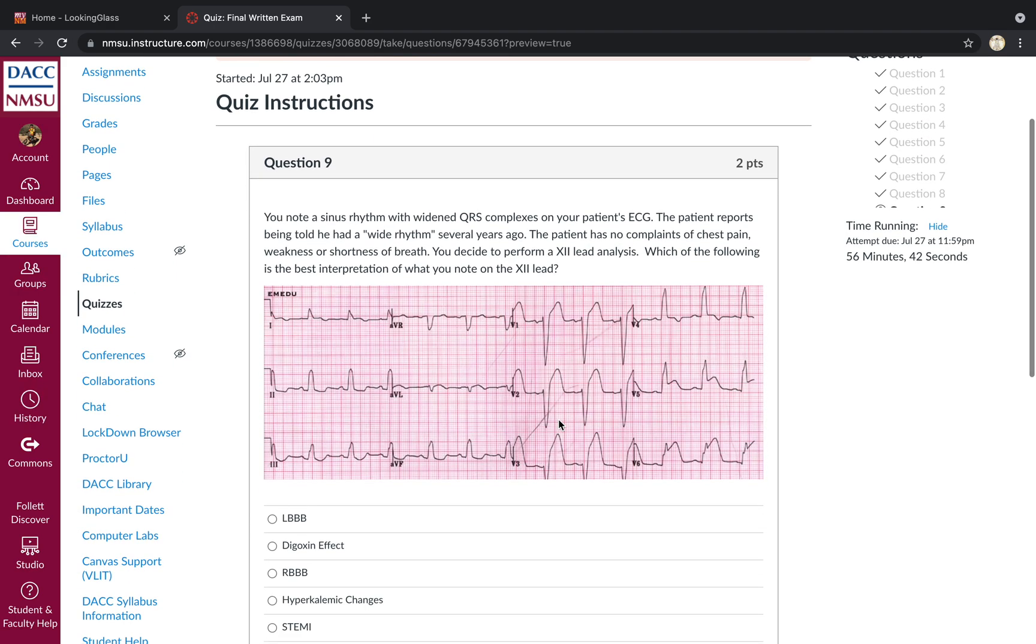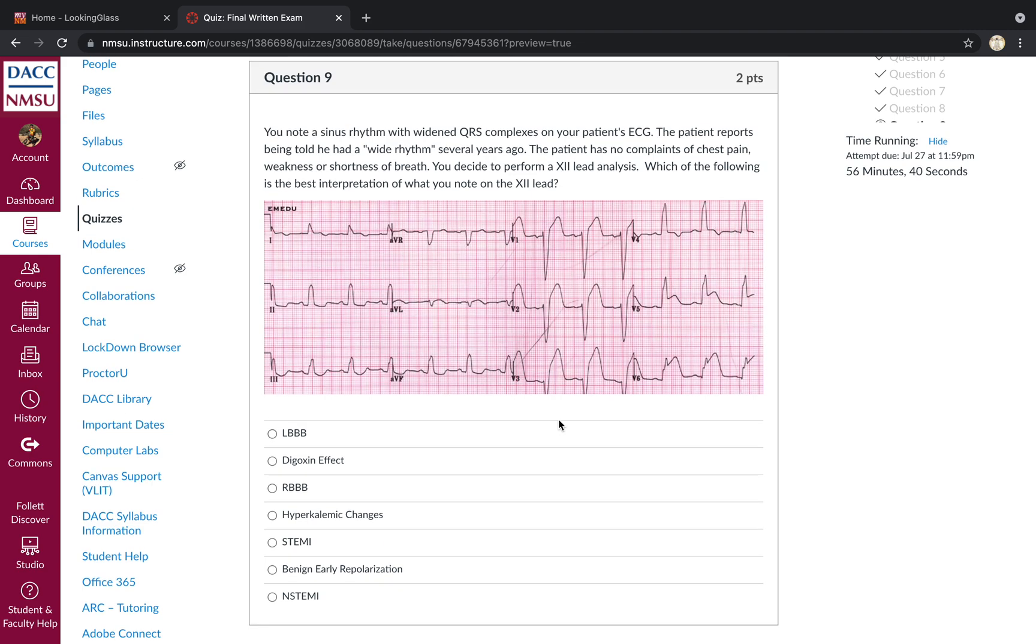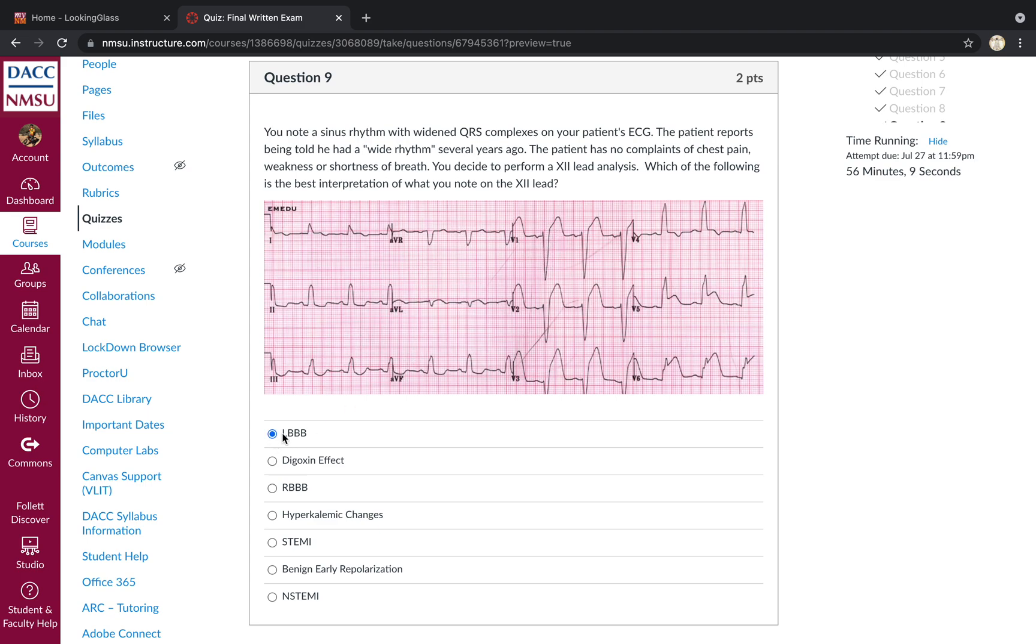Moving right along. You notice sinus rhythm with widened QRS complexes. Patient reports he had a wide rhythm several years ago. No complaints of chest pain, weakness, shortness of breath. Perform a 12 lead. What's the best interpretation of what we see? So you've got wide QRS complexes here. Otherwise looks like a sinus rhythm. So let's turn signal that. We go to V1. We perform turn signal criteria and we notice that it is a downward deflecting QRS complex suggesting, strongly suggesting left bundle branch block. Digi-effect. You do have some scooping here and there, but that is in just one lead. In lead three, you have some scooping. However, you don't really see that throughout.